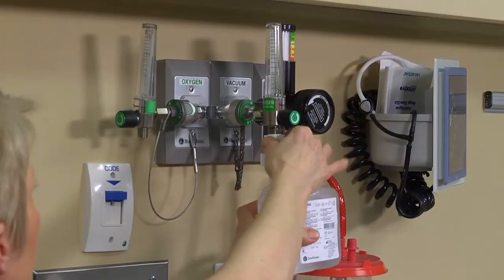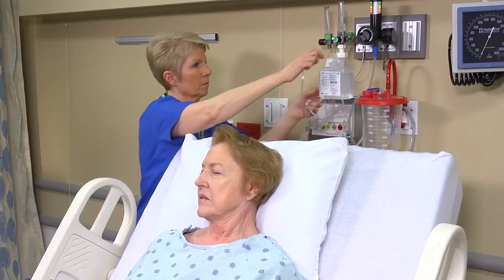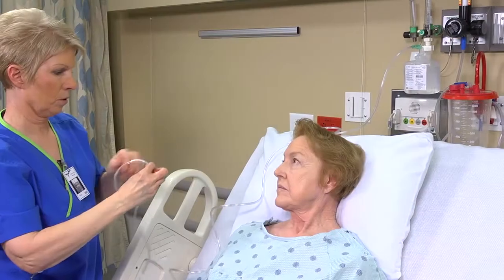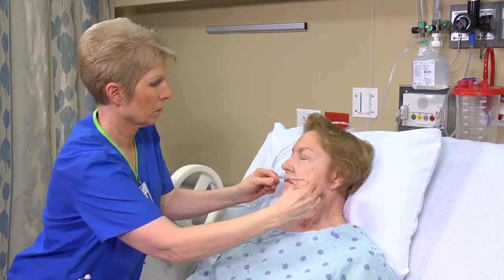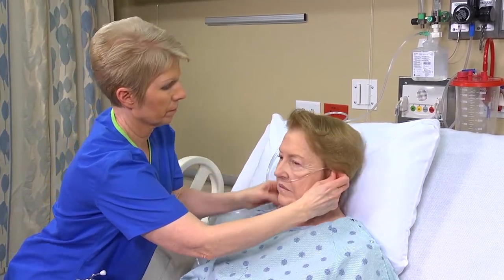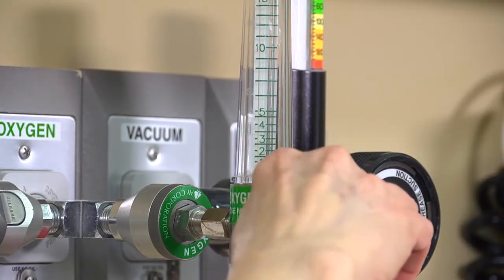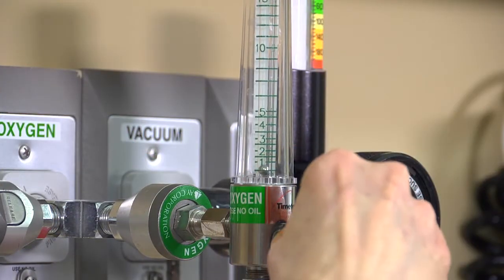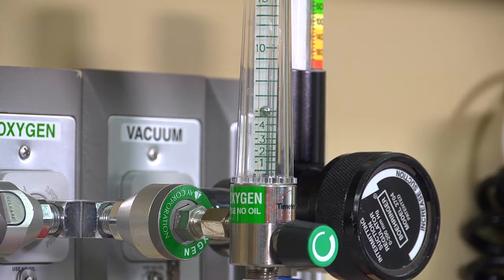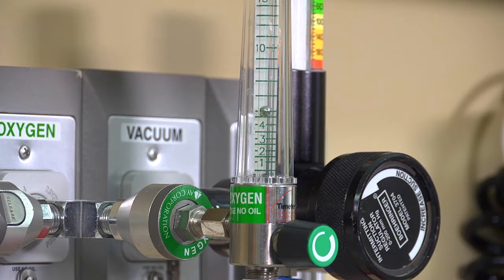If the ordered flow rate exceeds 4 liters per minute, attach the tubing to a humidified source of oxygen. Then attach the oxygen delivery device, such as a nasal cannula or mask. Turn the oxygen on and use the float ball on the regulator to adjust the flow to the prescribed rate, stopping when the ball is even with the number of liters per minute ordered.